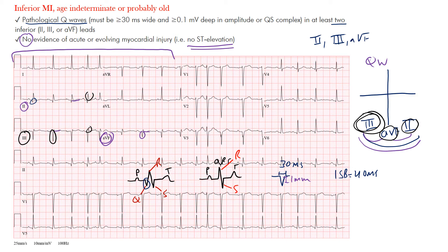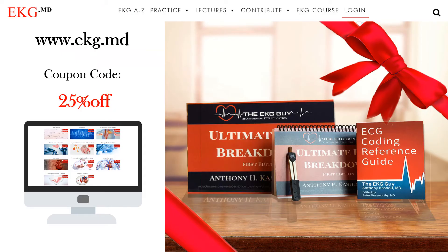In that case, you do have a Q wave present — those are the ones we're looking for. So in inferior MI, age indeterminate or probably old, you're looking for pathological Q waves in the inferior contiguous leads — at least two of them — and no evidence of acute or evolving myocardial injury, meaning no ST segment elevation in those leads.